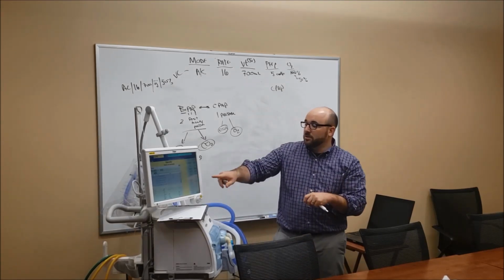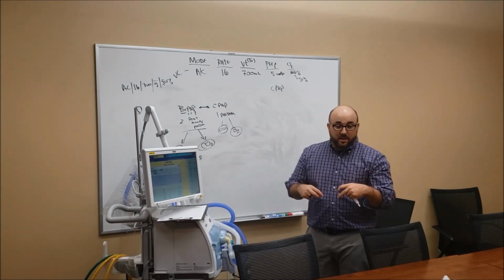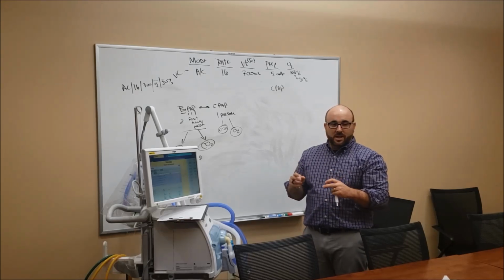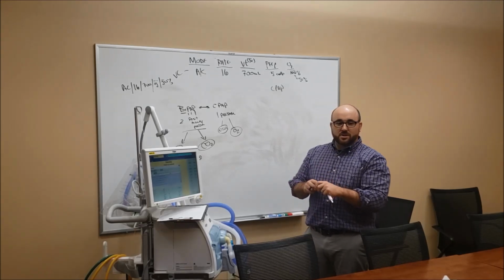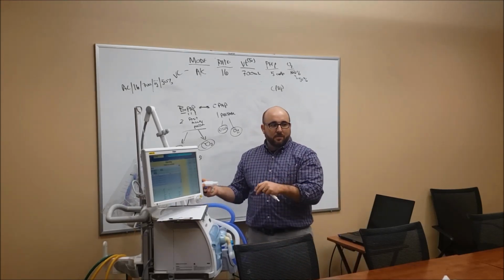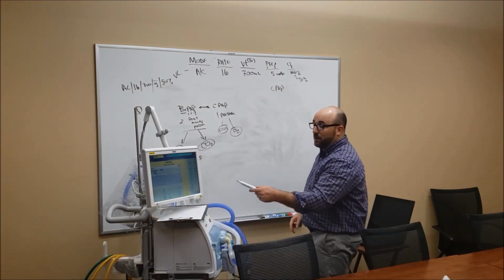So if you hit the O2 suction button and then walk away without resetting it, then pop off the ventilator, it won't alarm. So that's one real key. If you use the suction button, make sure you suction them, okay? It's extremely rare that would ever happen, but it's just something I always talk about when we talk about that button. But it's a great button for that.